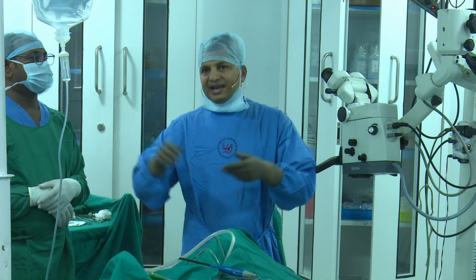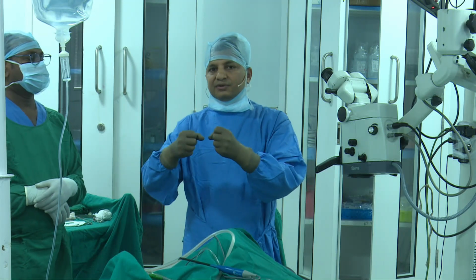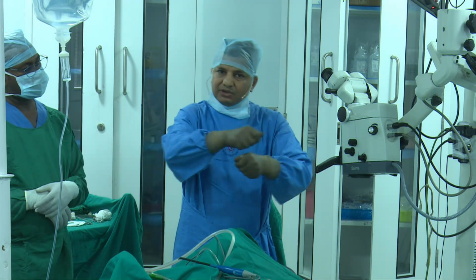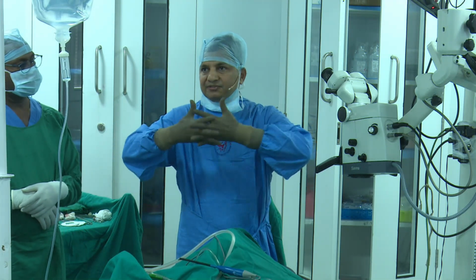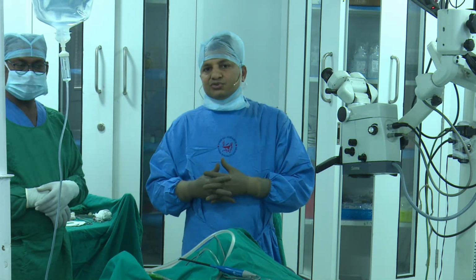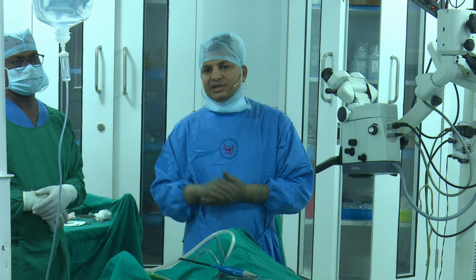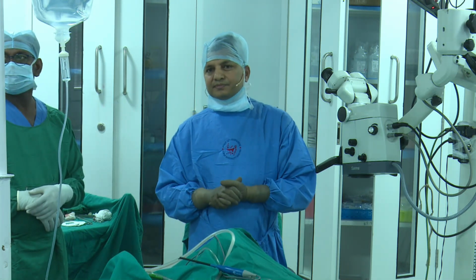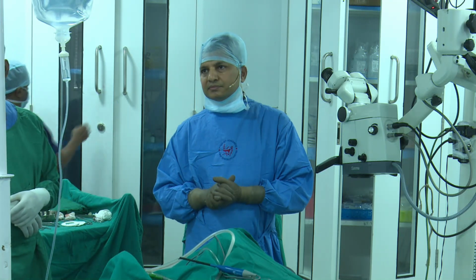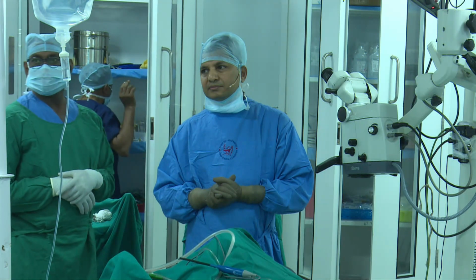I'm perfecting it. I showed you, I start 1 centimeter lateral so that it takes the strength of the whole raphe. Because if it is not sitting tightly, then the whole thing will open up. So it has to sit firmly. It should not be very tight, it should not be very loose. So I think it was my technique fault. It's not the suture's fault. I'm improving.